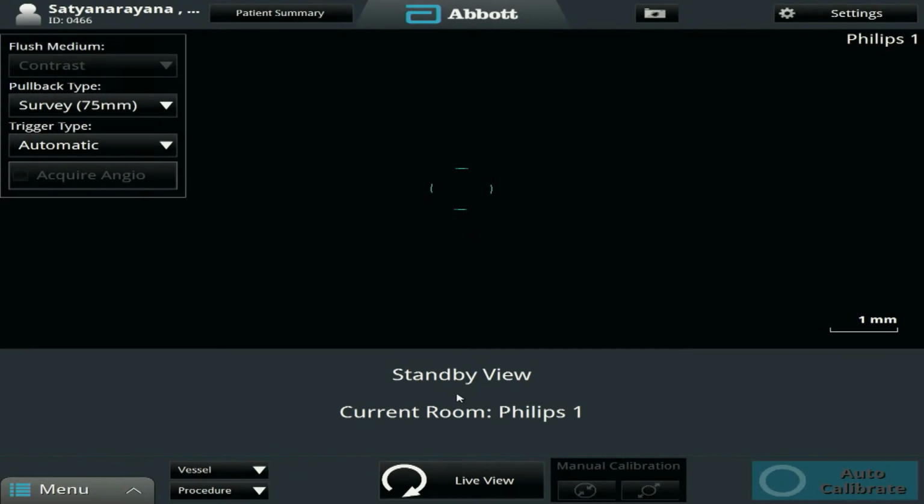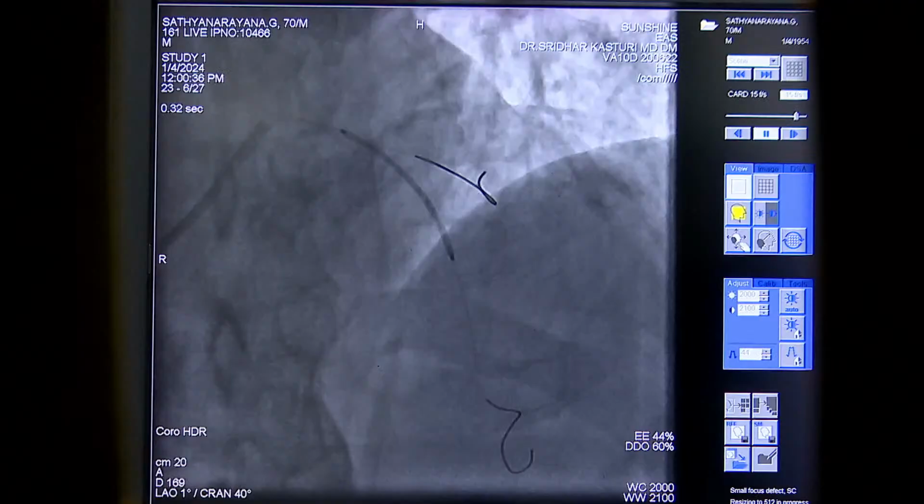Go. Small test. Just before the diagonal, land distal. Slightly 1 to 2 mm more. Go, test. I think that is fine. Okay, not needed. Go ahead. Small injection, you can take. But we are in a comfortable zone. We are not bothered.